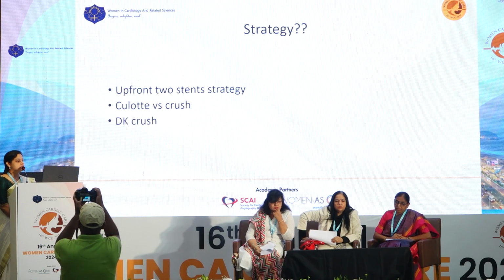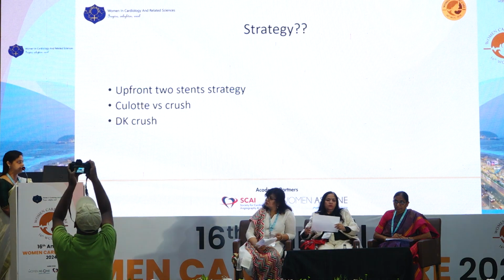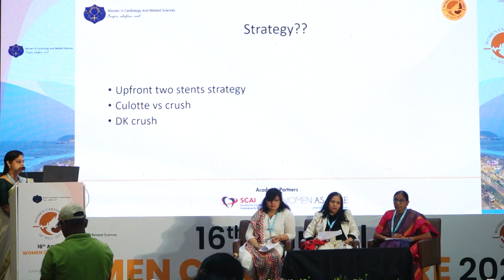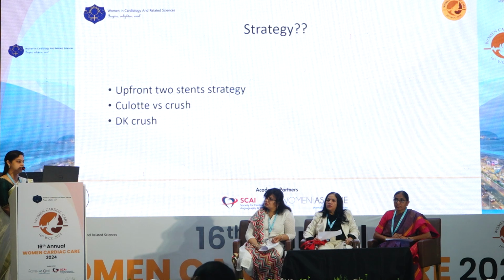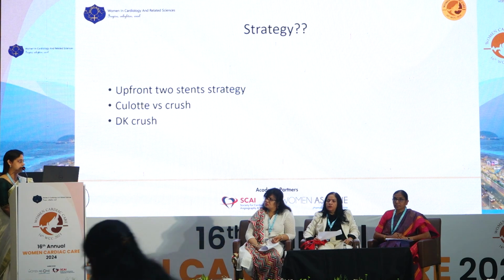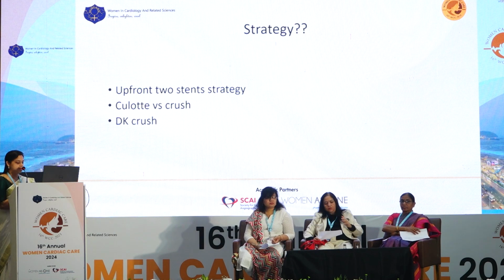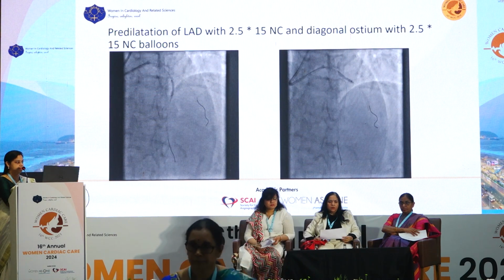strategy. Coming to strategy, considering the bifurcation angle, we ruled out TAP. So between culotte and crush, since the caliber is different between the distal LAD and diagonal, we thought we will go for crush. So we planned a DK crush strategy. Due to financial constraints, we couldn't use imaging for this patient.